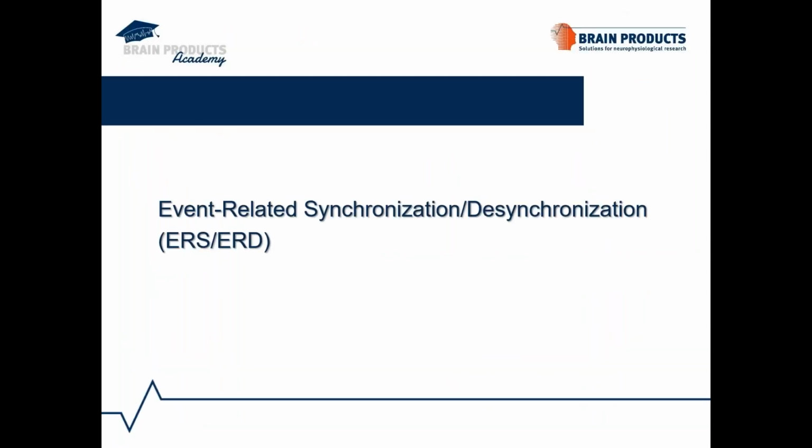Now, I would like to present another method that can also be used to investigate the spectral dynamics of an event-related signal. The method is called event-related synchronization or desynchronization, or in short, ERS-ERD.